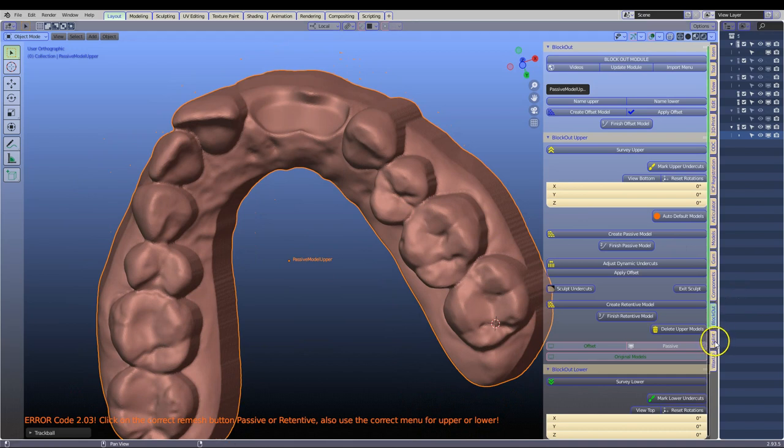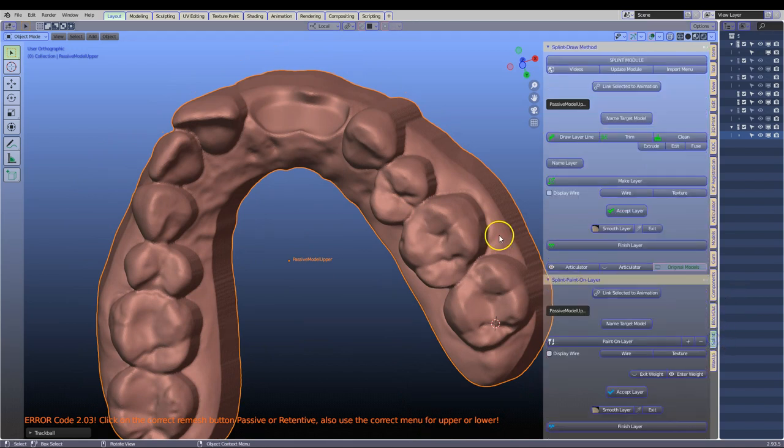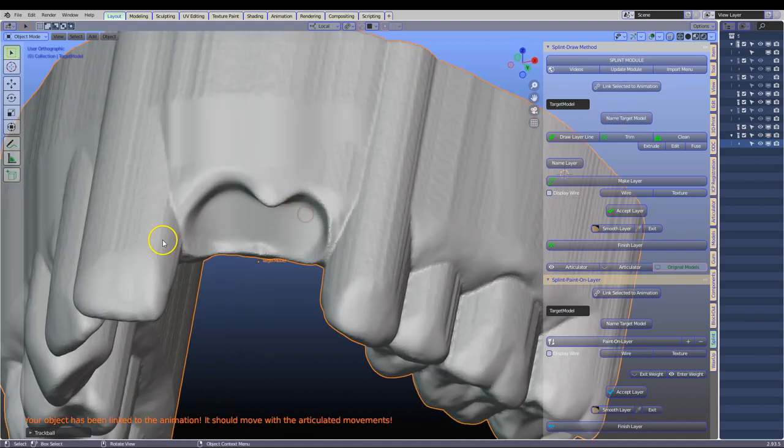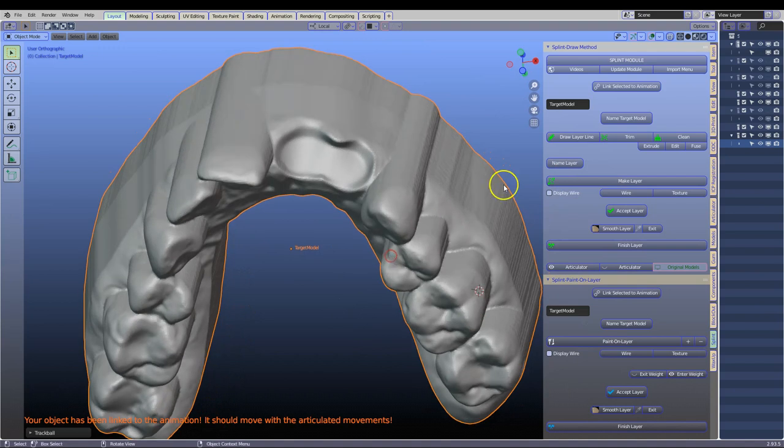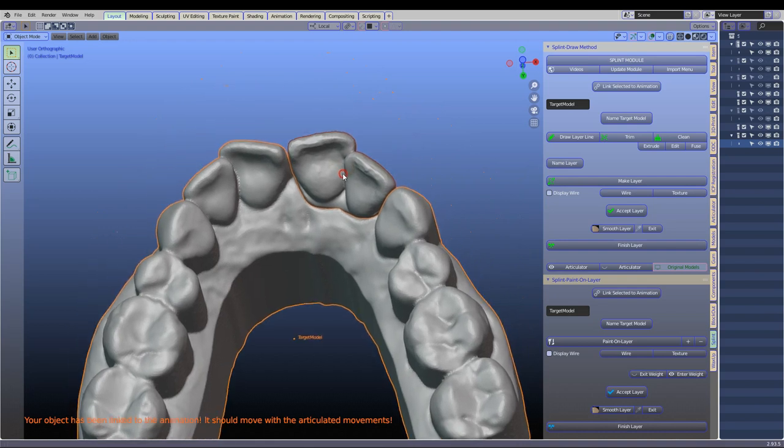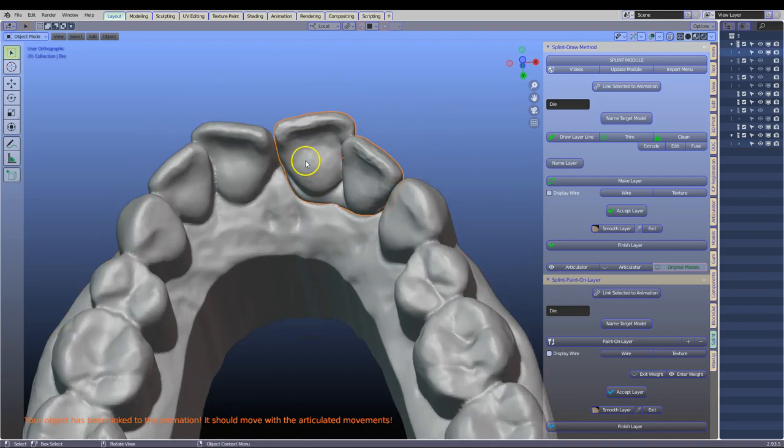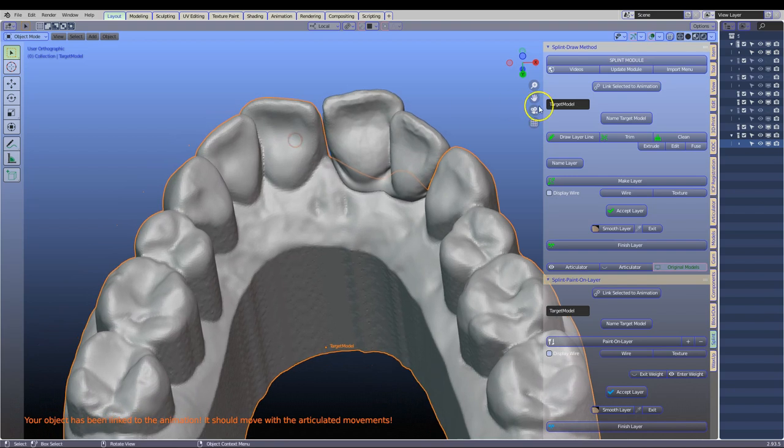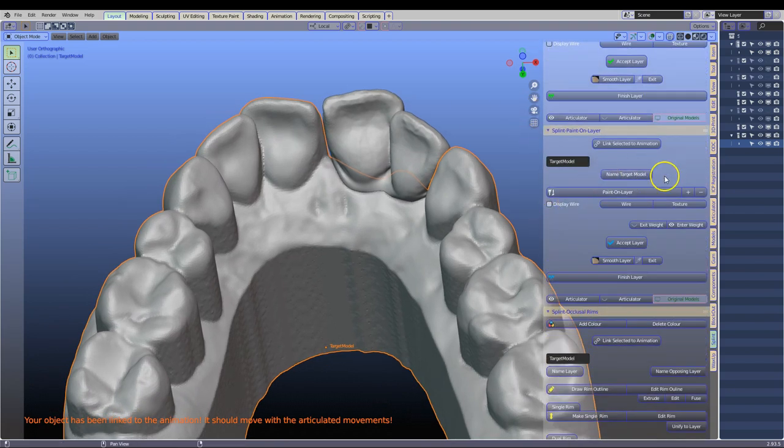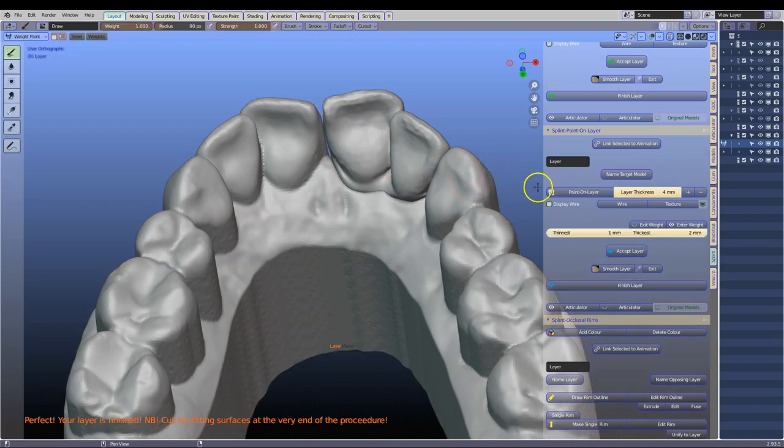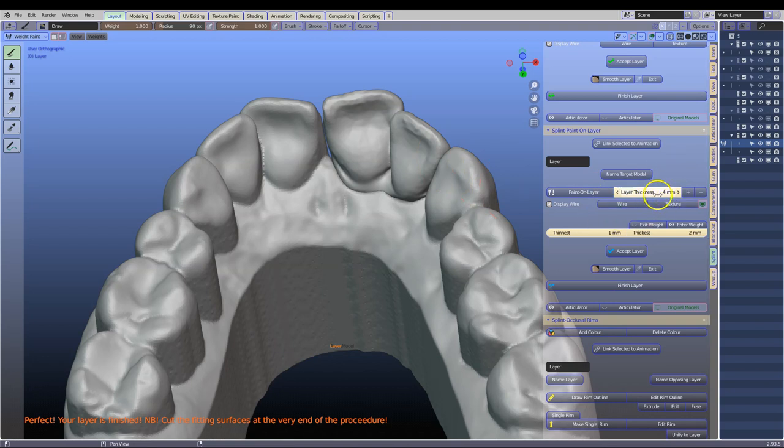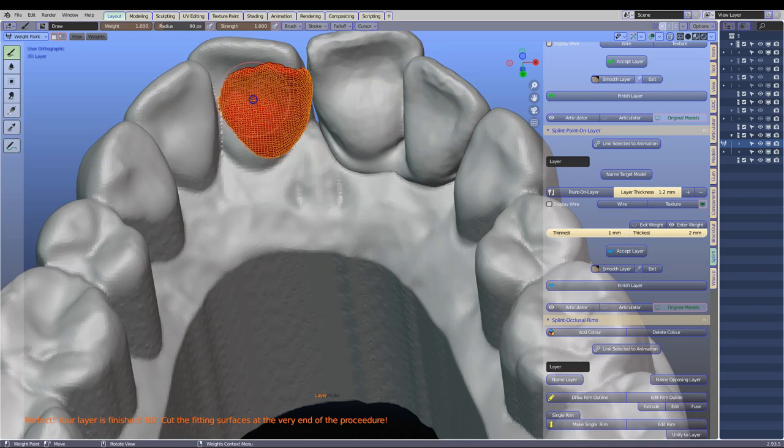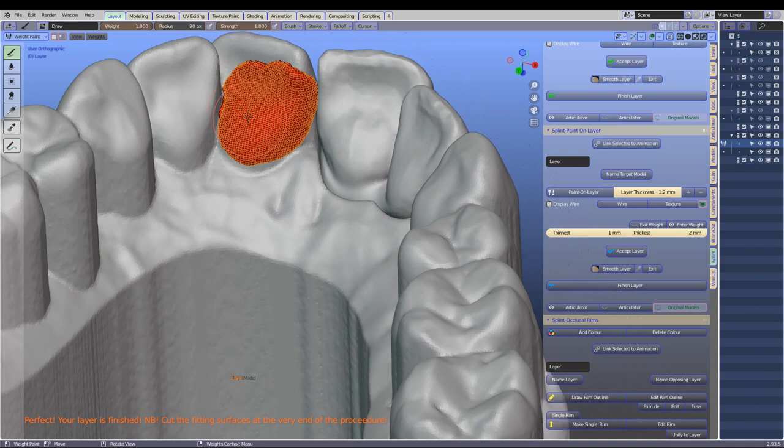We are going to go to the splint and layer module. Here we are going to name this target, the model which is a fitting surface. We can see how nicely it has been blocked out. We are going to then Alt H to unhide and then we are going to start painting. Click on paint layer. Now this layer can't be 2mm thick. Say you are milling out of whatever. We are going to say 0.6mm thick. So let's put this at 1.2mm which is always double and then zoom in a little bit and start painting your wing. Now we have to also consider the occlusion with this wing as well. But in this case I think it was out of occlusion.